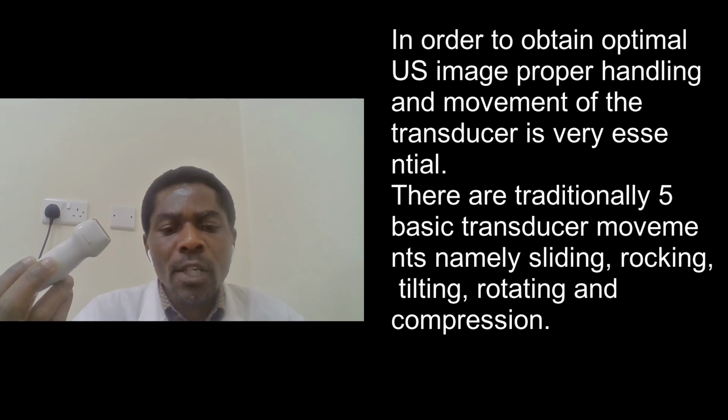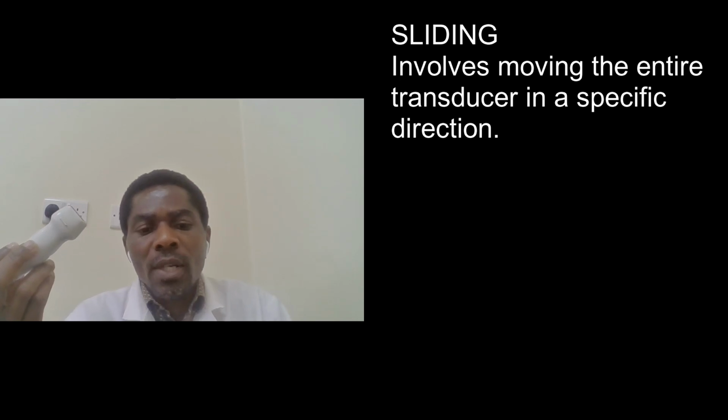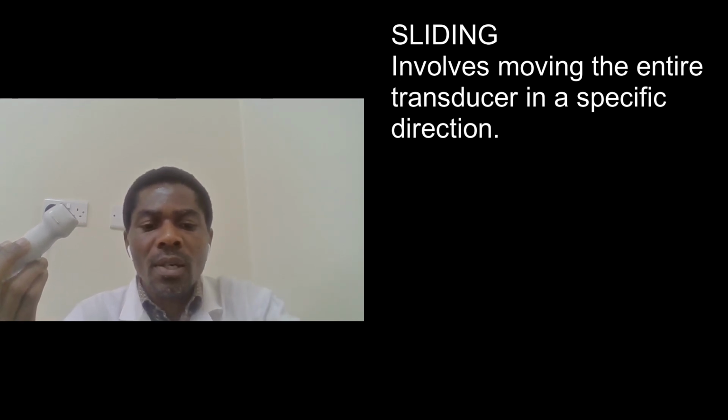There are traditionally 4 basic movements that are performed when scanning with ultrasound, and these are sliding, rocking, tilting, and rotating. There is also another technique that could be considered as 5th cardinal movement, and this is compression. So let us start with sliding.